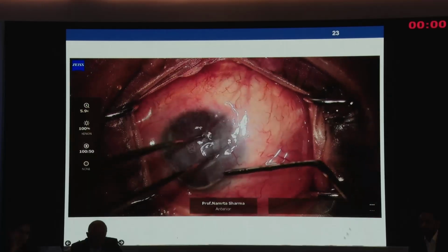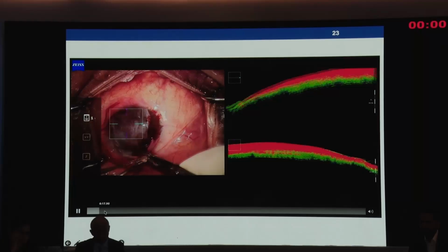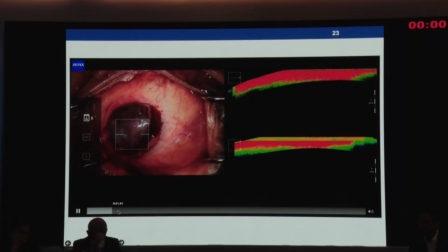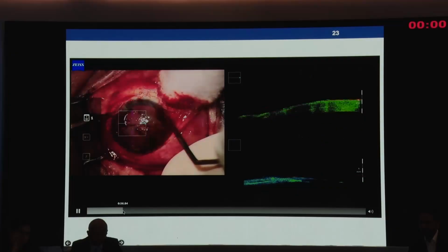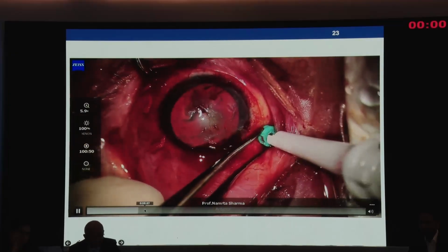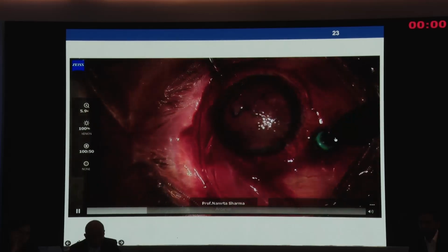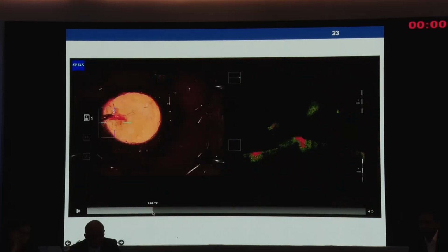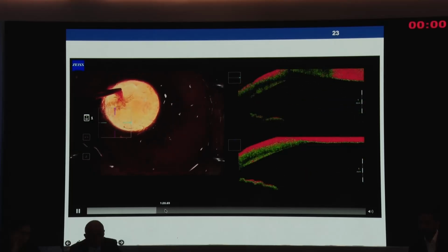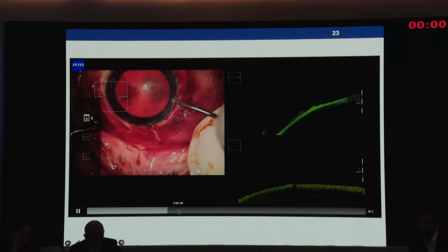Again, this is a case where pannus was there, and we removed the pannus, and sometimes you can be really surprised, and like I always say, that eye is over there and you have to dig it out. So you dig out the eye from here, so remove the entire pannus bit by bit, tease every fragment. It requires a lot of patience. And then here chandelier has been put, and once you put a chandelier, you're completely in a different world of visualization, different world of also doing surgery. Because when you do surgery, it feels differently.